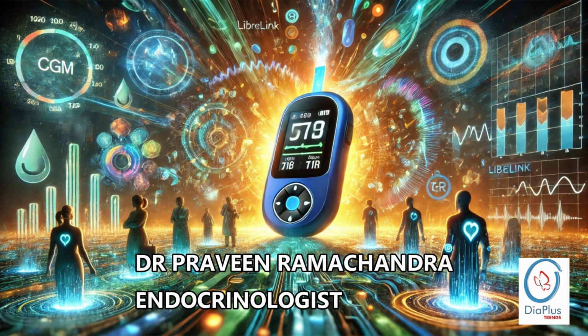try testing at different times, like before and after meals. Oh, that's a good idea. So just being more proactive and observant with how we test. What kind of information can we get from that? You'll start to notice patterns. You might see that your glucose spikes consistently after certain foods or dips at certain times of day. And that knowledge can help you make changes to your diet, activity, or even the timing of your medication.